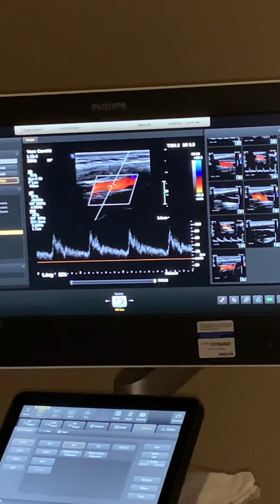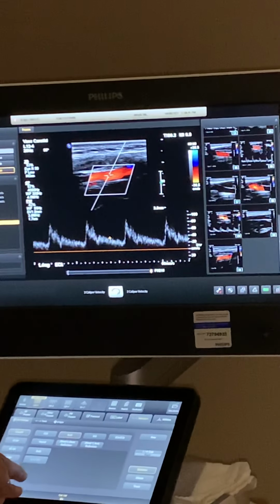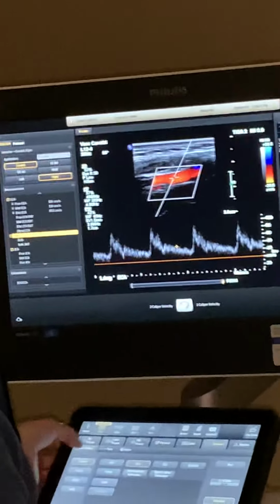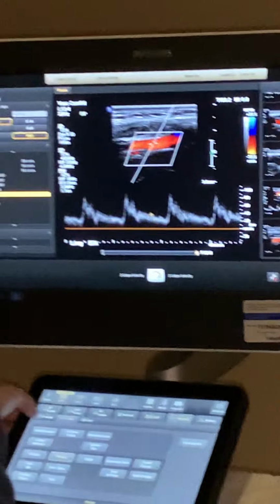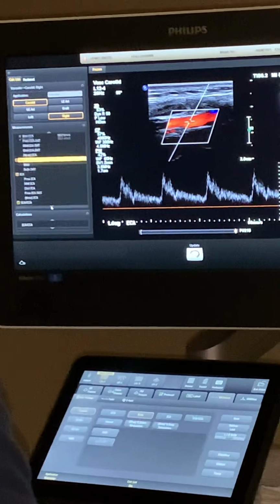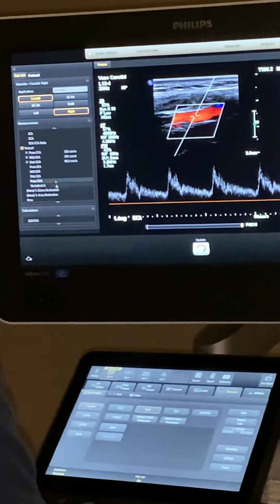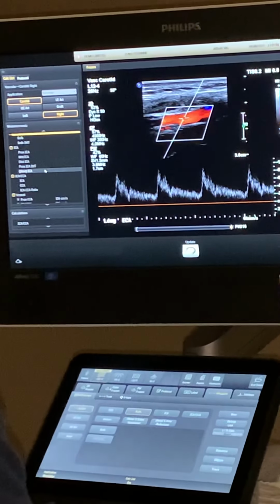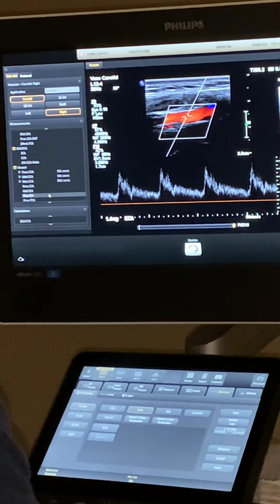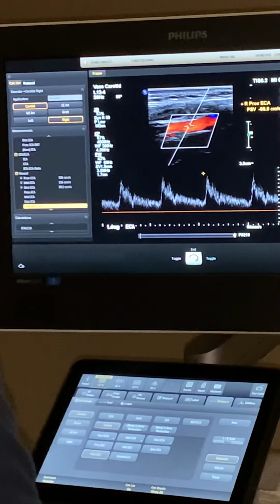Hey, where's my... Oh, go up to the side. I don't know why it's not on the... I go up to the side panel with my arrow because you have to scroll down to see it for whatever reason. Oh, okay, I see. Over here. I don't know why it's not on that screen right there. Where is it? Right there, go down. Did I miss it? Yep, go down. Right. Oh, here it is. Yep. Okay. Well, that's weird, but okay.